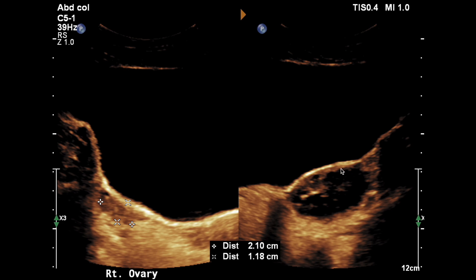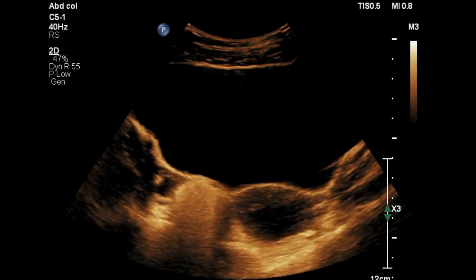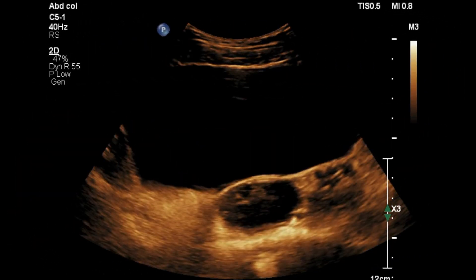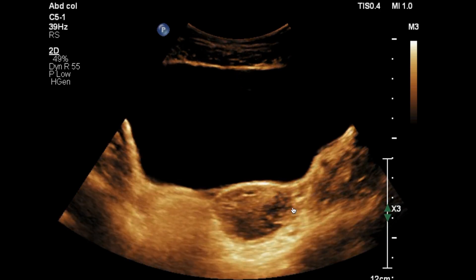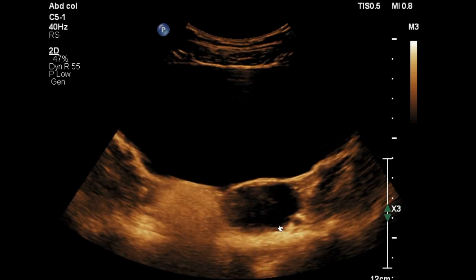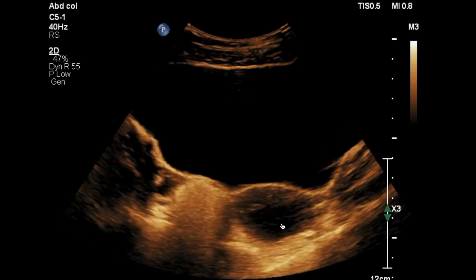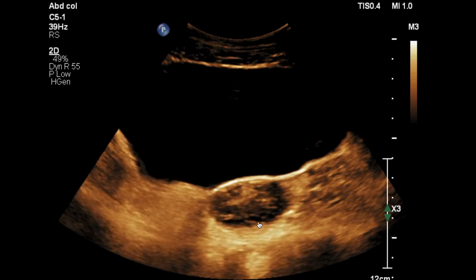Let's see on real time. Here on real time you can see the left ovary is enlarged and there is a cystic lesion within the ovary. This cystic lesion shows internal septations.